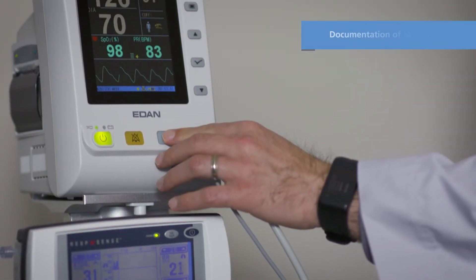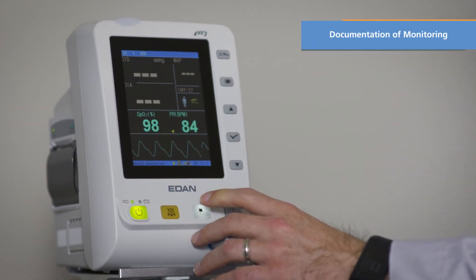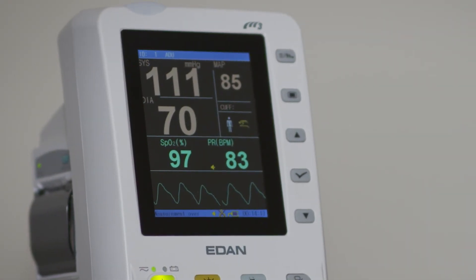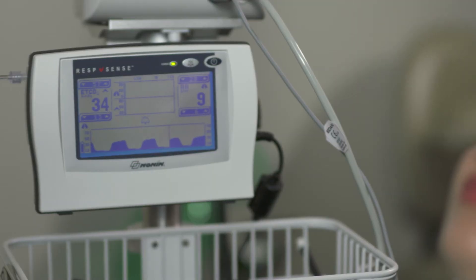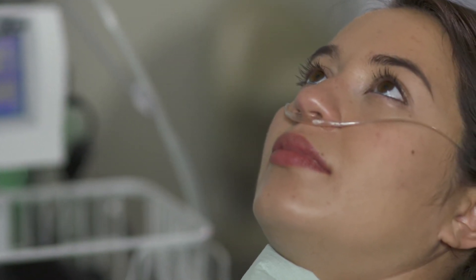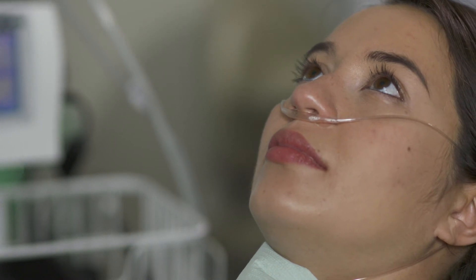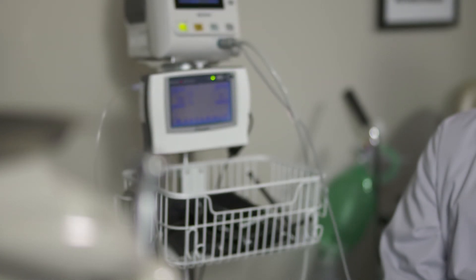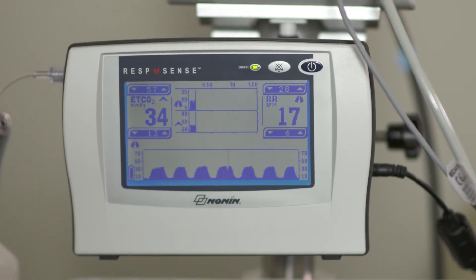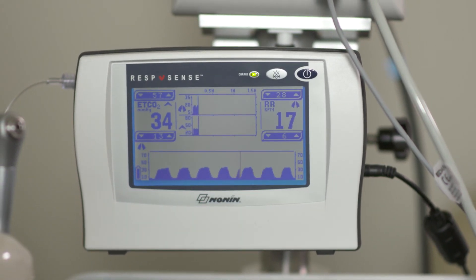Before beginning the procedure, it is important to check all of your patient's vital signs and document them. Check vital signs again operatively and postoperatively to confirm the patient's recovery and identify any adverse responses to the sedation. Follow the documentation protocol already established in your practice. The monitor also has memory capability — data are automatically stored in memory and may be downloaded and saved in the patient's record in an EMR system. Data should be downloaded after every patient.